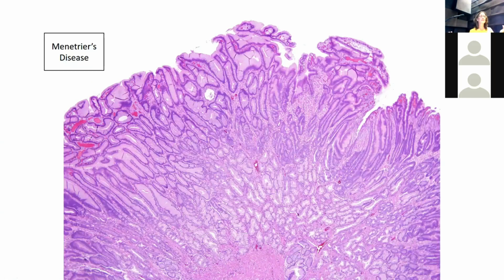Okay, but this is what you see under the microscope, and it's pretty darn boring. You basically get something that kind of looks like a hyperplastic polyp of the body. The parietal cells have been squashed down mostly out of existence. If your colleague gets you a biopsy like this, you're going to call it a gastric hyperplastic polyp 24/7. The good news is that usually if you get a biopsy of this, the gastroenterologist or whoever scopes the patient is scared. They know something's off, and they'll rush it or they'll fuss about it or call you. So you usually don't have to get fooled, but you can.